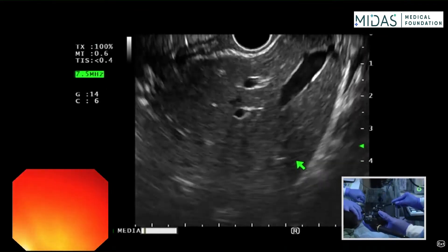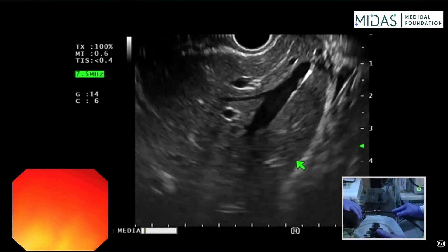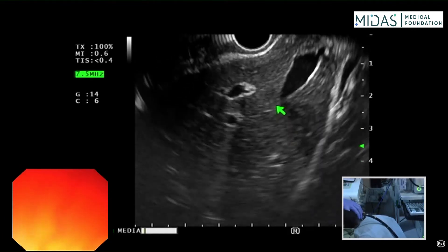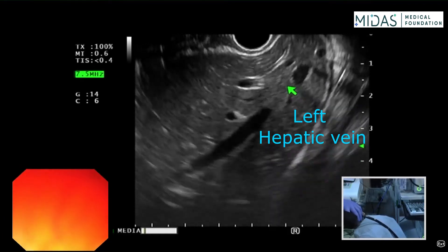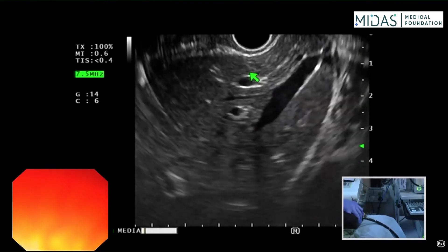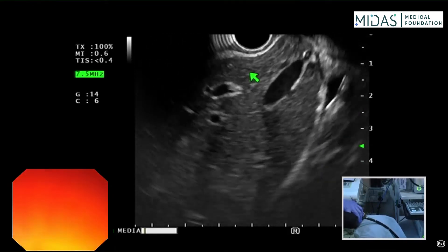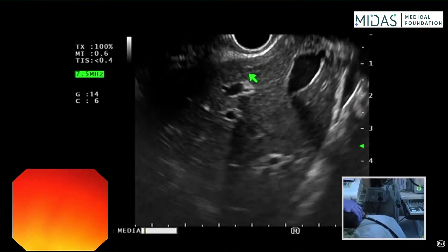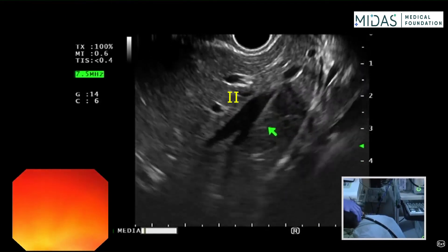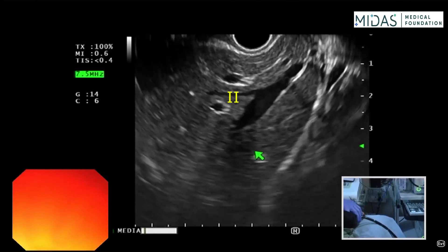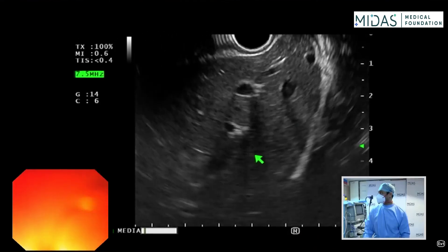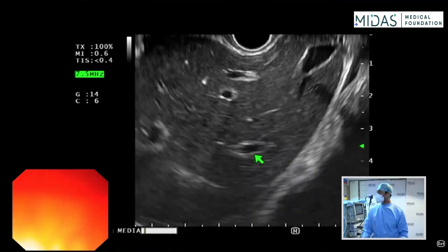Now applying more counterclockwise torque until we see the left hepatic vein. Between the transducer and the left hepatic vein is segment two, and below is segment three. This is the left lobe of the liver.